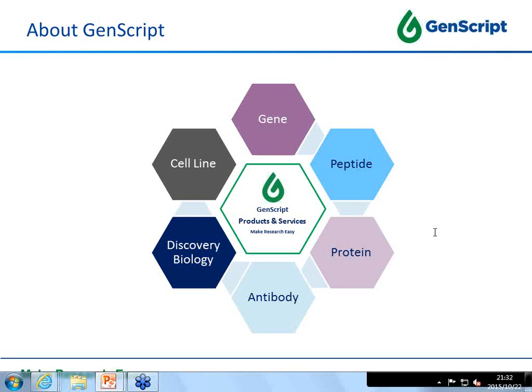That was useful. I know you addressed this in your presentation, but another question that came up is what media we use for cell culture work. For cell culture work, at the moment we use commercial cell culture medium. The components of the medium you can easily find on the website and download them. It's just a commercial medium, but we are also working on developing our own medium. Okay. And you said for the CHO-GS cell line, you use animal-free, chemically defined medium, right? Protein-free, serum-free, yes. Okay.